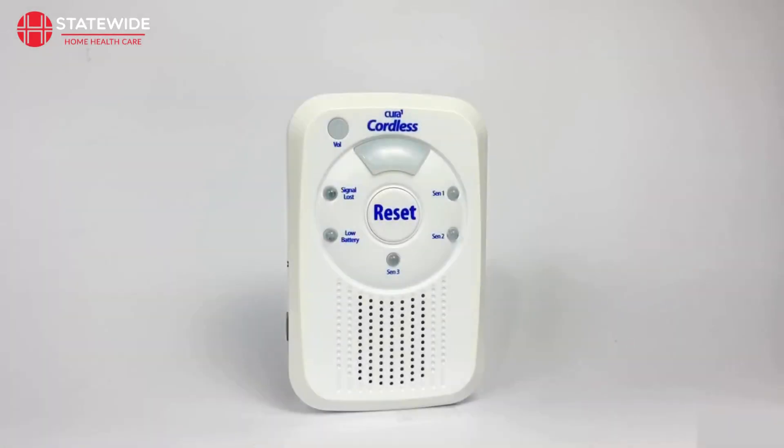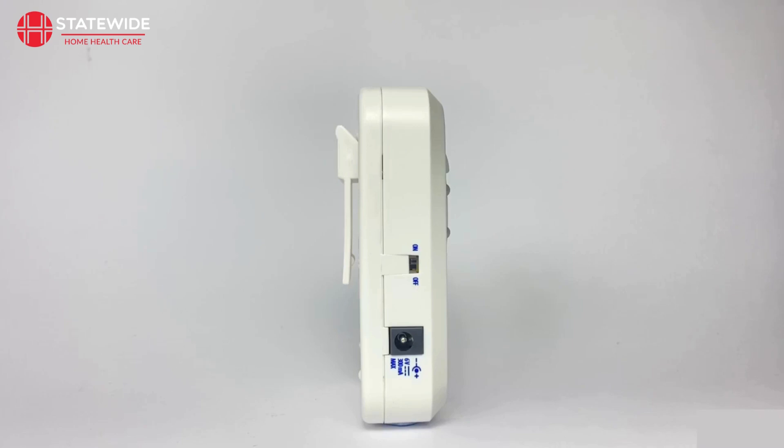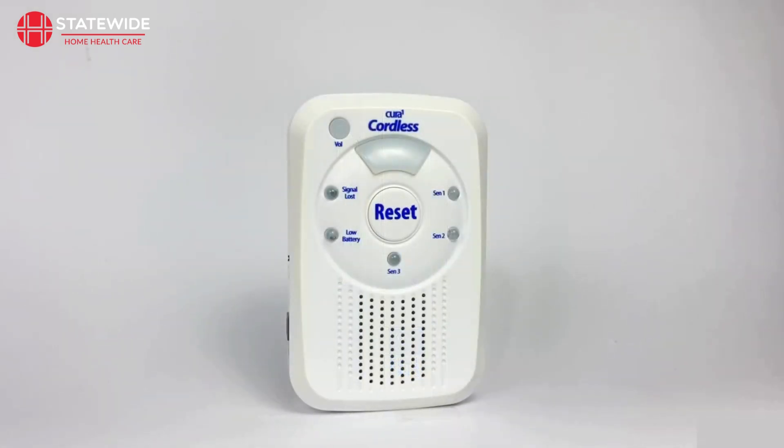With your devices paired to your monitor, you can now place the equipment where you would like them to operate. Your monitor has the option to work with a mounting bracket accessory available separately, allowing you to keep your monitor mounted on a wall. You can also use the clip on the back of the monitor to hang the device from a carer's belt, allowing them to carry the monitor around as they go. When an alarm is sounding, you can adjust the volume level using the vol button — there are three different volume levels to choose from. To clear an active alarm, simply press the reset button in the middle of the monitor. The alarm will keep sounding, along with illuminated LEDs, until the reset button is pushed. Your setup is now fully ready for use.